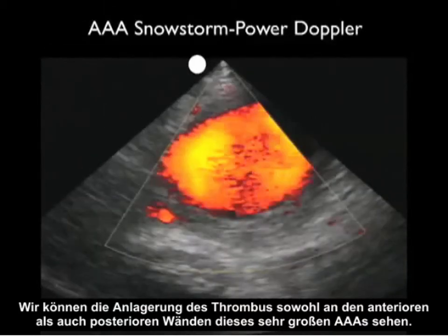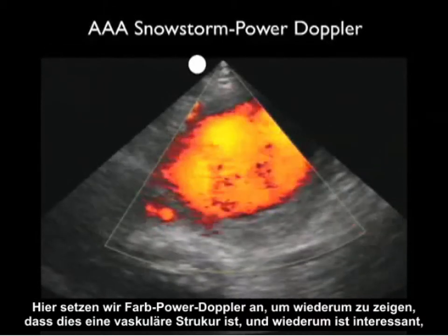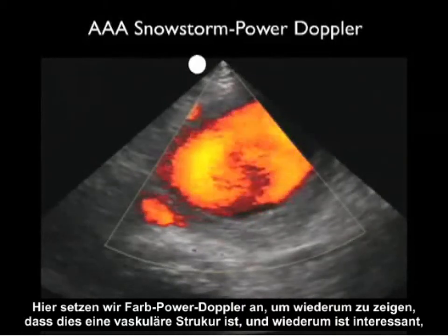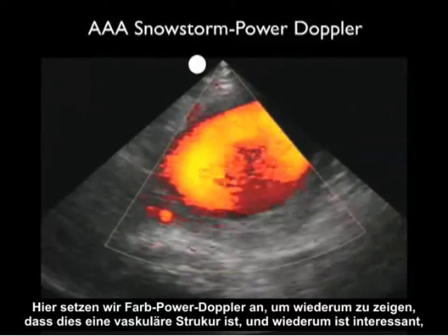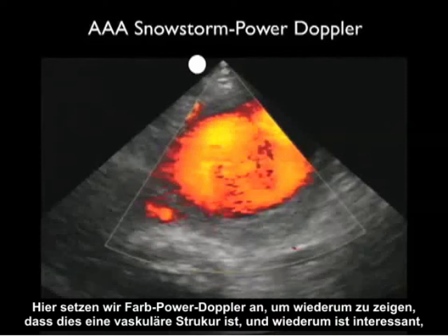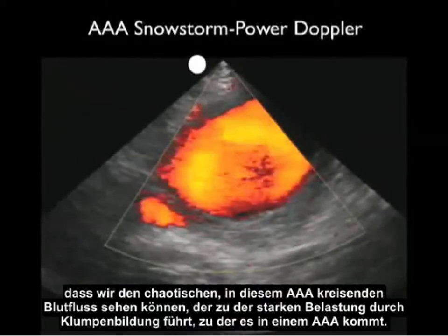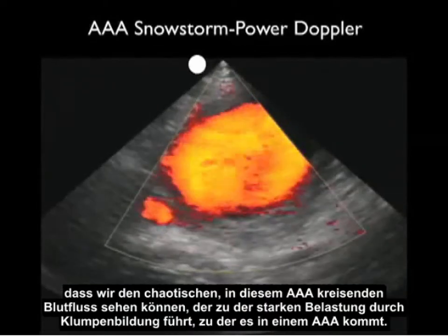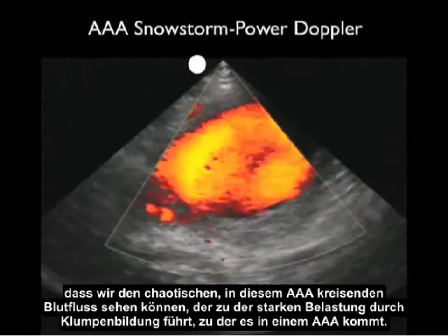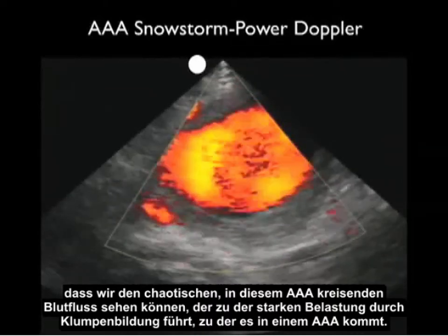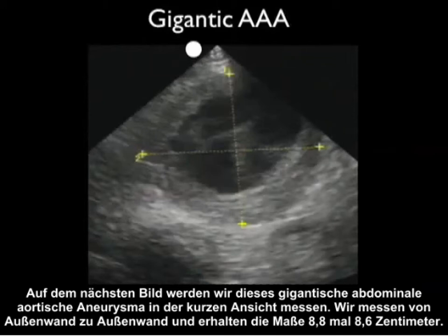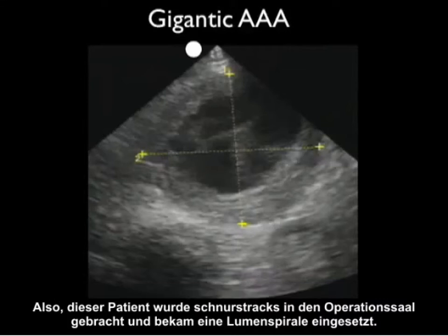Here we're putting color power Doppler down to show that this is a vascular structure, and we can see the chaotic flow of blood round and round within this AAA that contributes to the substantial burden of clot formation. Measuring this gigantic abdominal aortic aneurysm in the short axis orientation from outer wall to outer wall, we get a measurement of 8.8 by 8.6 centimeters. This patient went directly to the operating room and had successful placement of a stent.